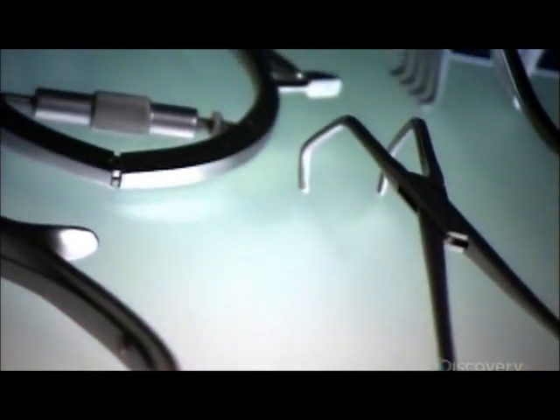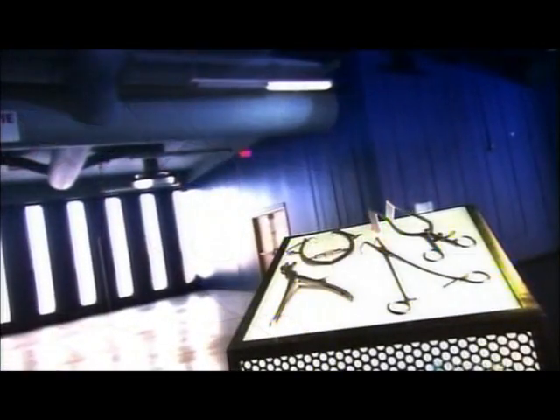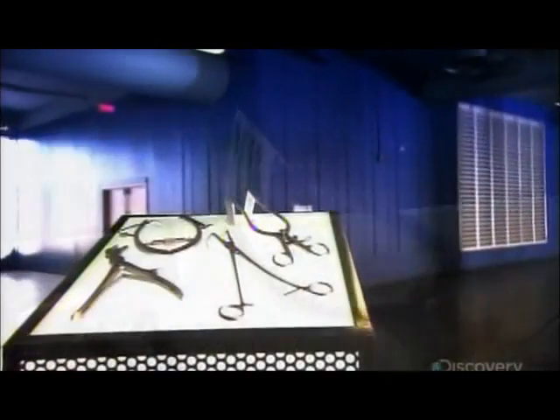Surgical instruments have evolved with the science of medicine. They actually date back thousands of years, when primitive man used crude implements to cut holes in skulls to release evil spirits. Medical science has come a long way since then, and today's surgical tools are among its advancements.